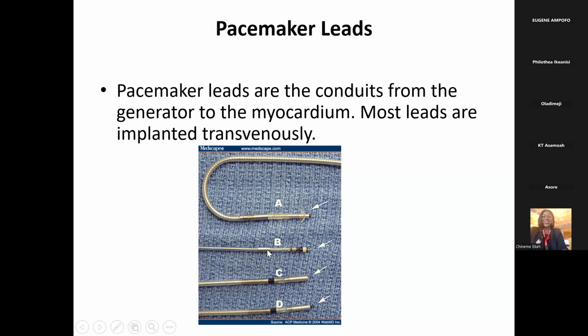Now, also one important piece of information we should have here is this metallic region, where my arrow is showing. The metallic region confirms to you that this person is going to have a ring electrode and a tip electrode, telling you it's bipolar. The ring electrode will be positively charged. The tip electrode would be negatively charged.